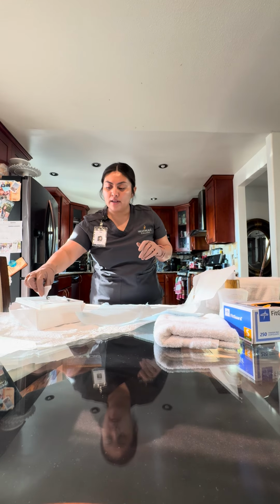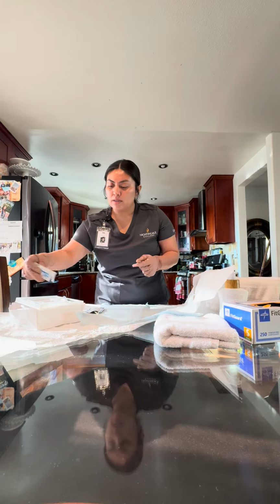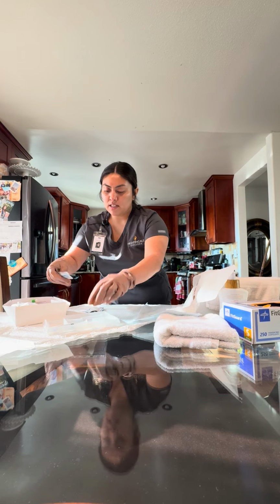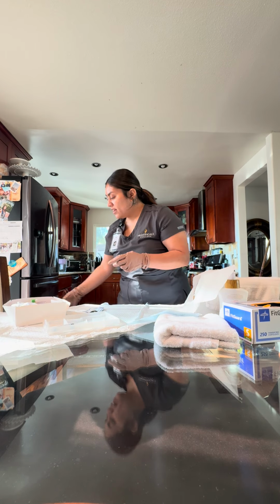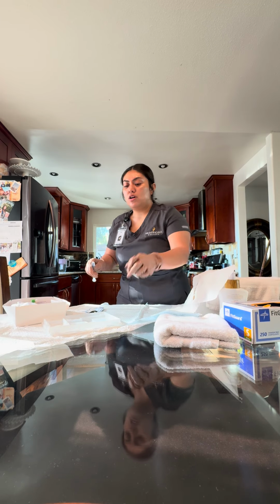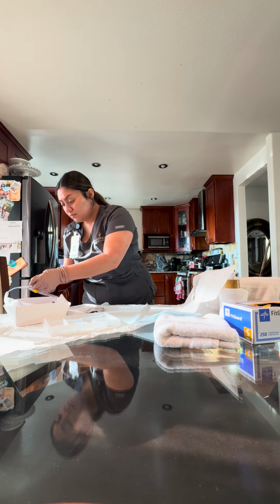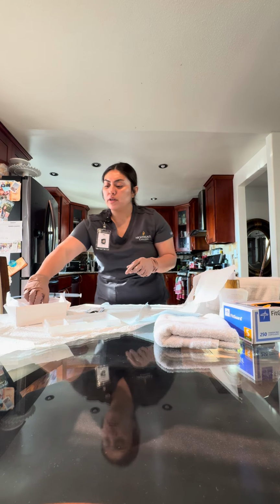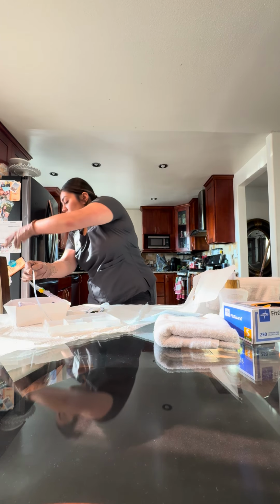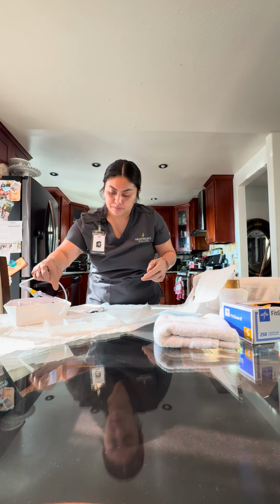I'm going to be grabbing the cotton swabs and removing the packaging. I'm going to be placing some lube down and discarding that packaging. I'm also going to be placing my syringe on my Foley catheter. After that has been placed, I'm going to be removing my catheter from its sleeve and discarding that, placing it in some lube.